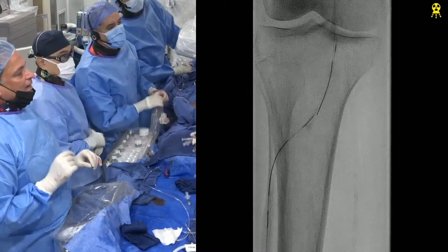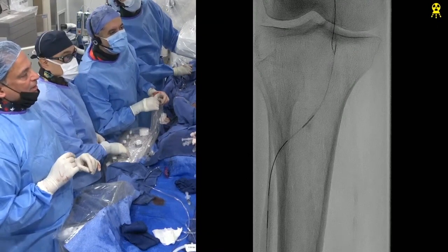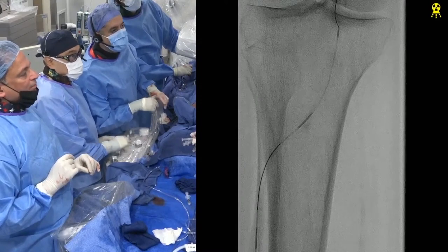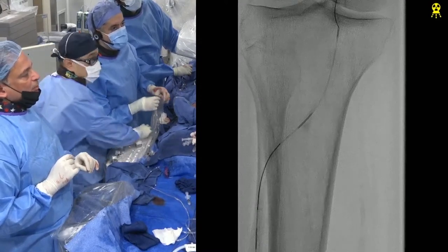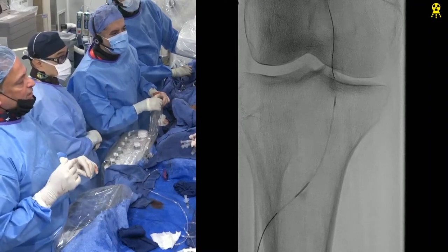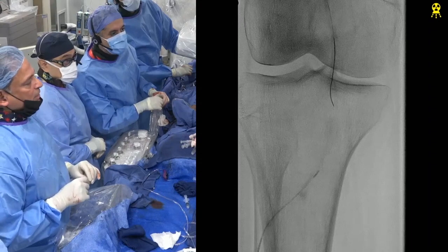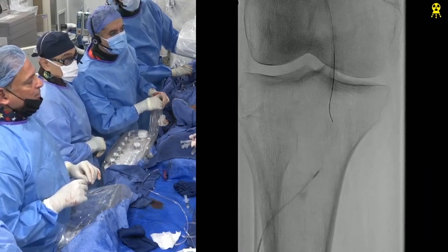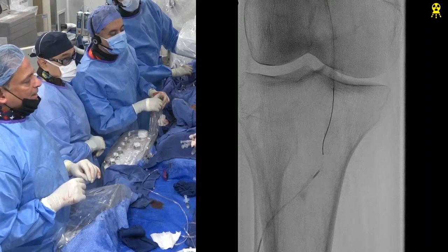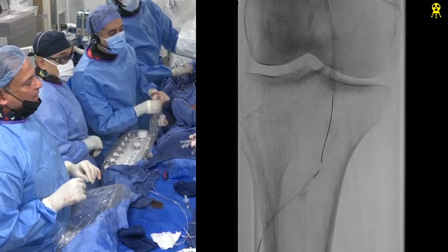When you track a catheter through a balloon segment, you're always going to get in trouble. You've got to be very, very careful with those kinds of things. You have a wire in front and then do it just like with a loop here. So coming from below, even if Vishal had created a dissection plane from above, that's a different story. How about there, Vishal? That angle might be more favorable for you. I think that is the significance of coming from below versus above.